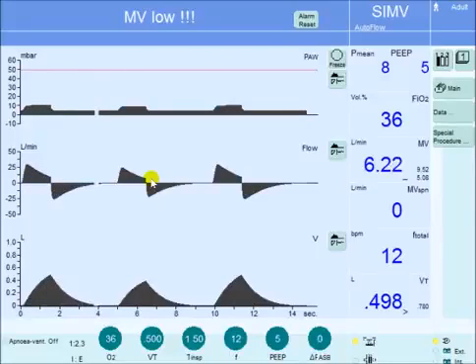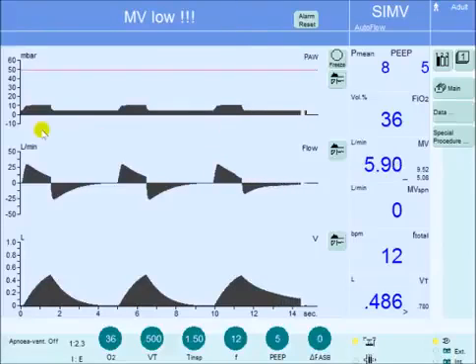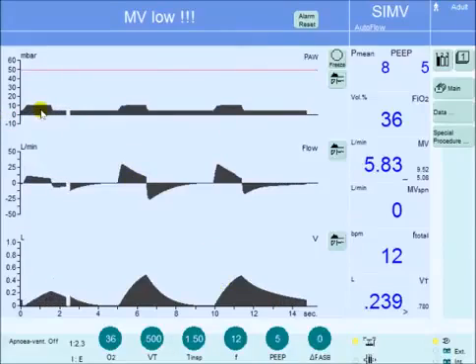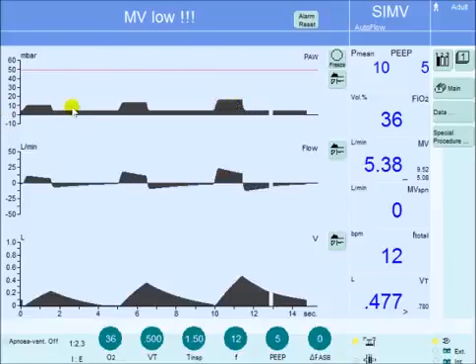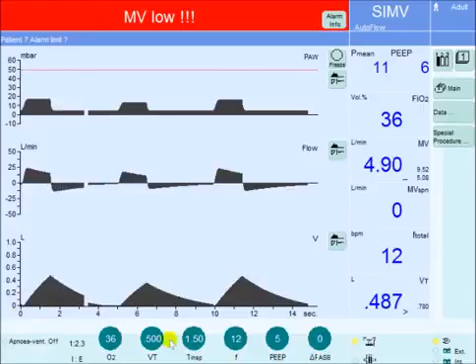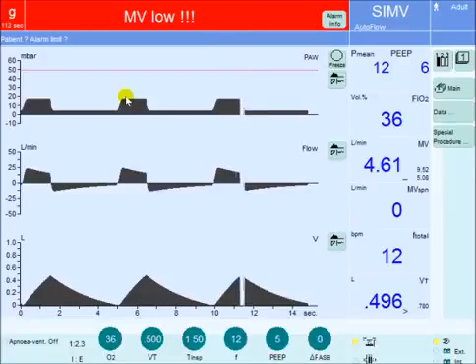In pressure-regulated volume control, or Auto Flow on Draeger, if the resistance is increased, the next breath will be delivered with the same pressure and results in a much lower tidal volume. At that point, the pressure will go up gradually by 2-3 cm each breath. You can see the gradual increase in pressure and the gradual increase in tidal volume, until it gets to the target tidal volume of 500. At that point, the pressure will be maintained at this new level.